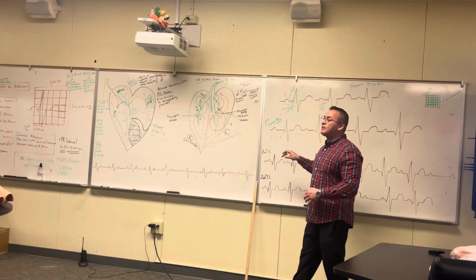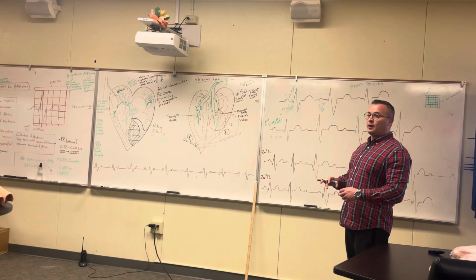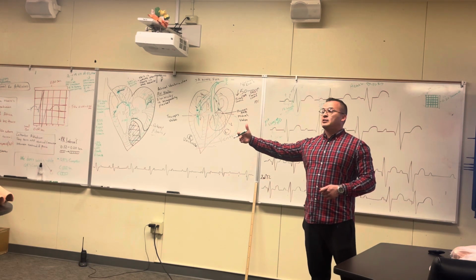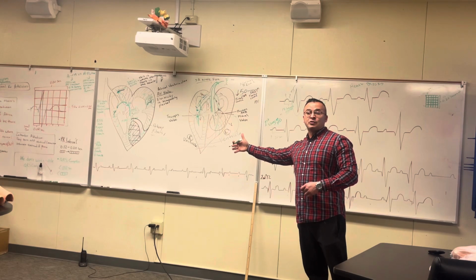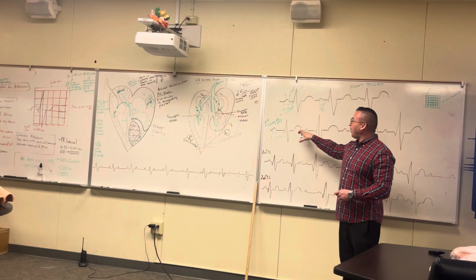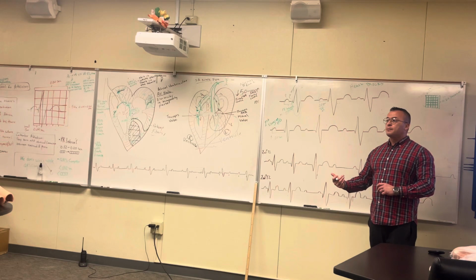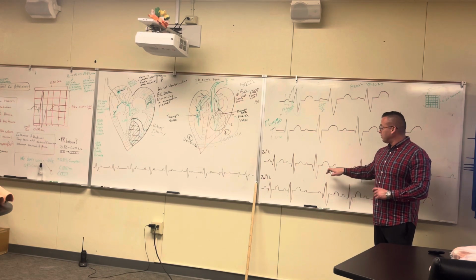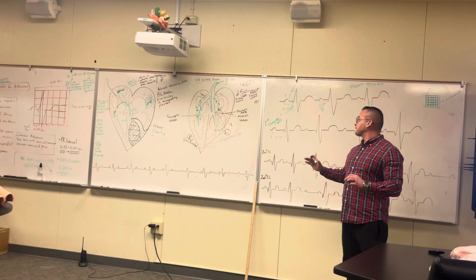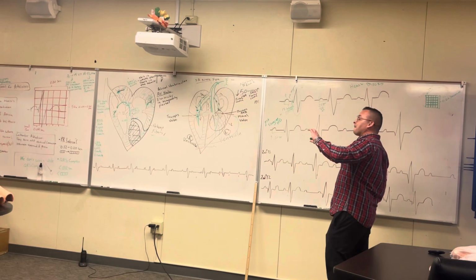And this actually is not even a big deal. It could be the patient is taking a certain drug, and I won't get into those drugs right now. It could be the patient is going to be having some other issue down the road. But generally a first degree heart block by itself, the doctor's not really concerned too much. They're gonna keep an eye on it to see if it gets worse or if it turns into one of these, but by itself, it's not a big deal. Any questions about this one? Okay, so one more time.